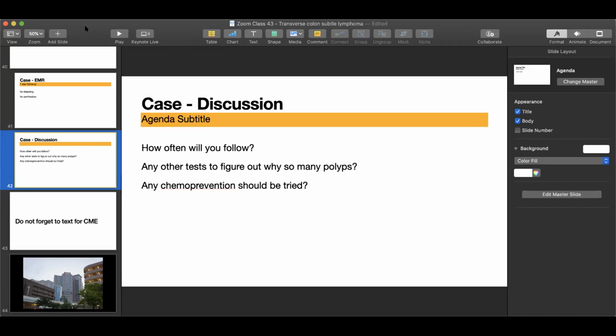I think I should comment on your equipment. The pediatric colonoscope that was used probably did not have the right optics to give you the high confidence to make the diagnosis of SSAs or to use the NICE classification. We have shown that in a randomized trial before. You will need something that has a near focus. Back in 2015 and 16, and Ravi was there, we gave our specification, and it was designed and tested in Singapore, of the proper colonoscope for this, which is a pediatric with a near focus. Now it is available worldwide.